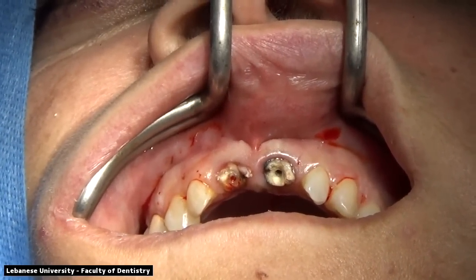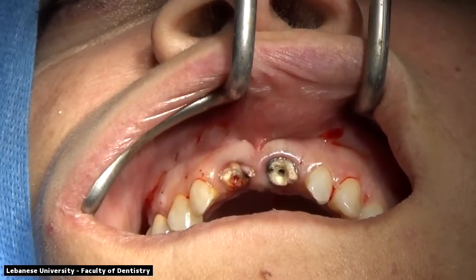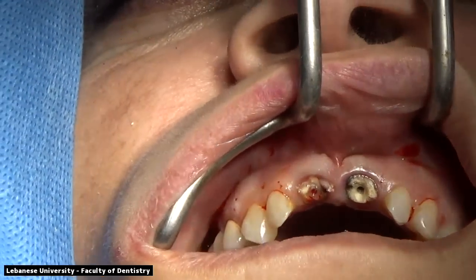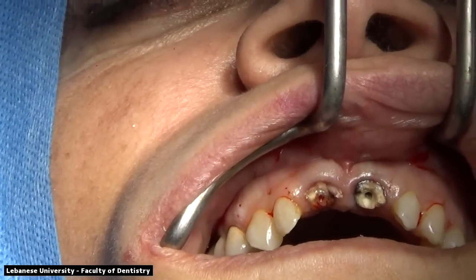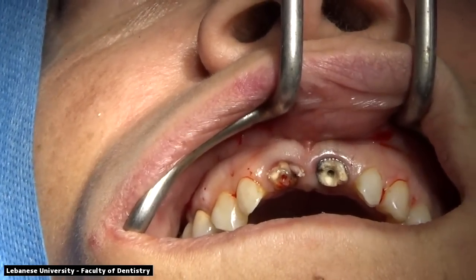It's very important that the margins be flush, that they be completely smooth, and that there is no irritation to the marginal tissues of the soft tissue around the implants that will be placed, especially since we are placing tissue level implants in this case.